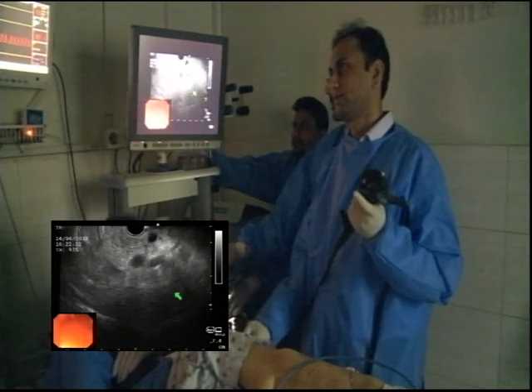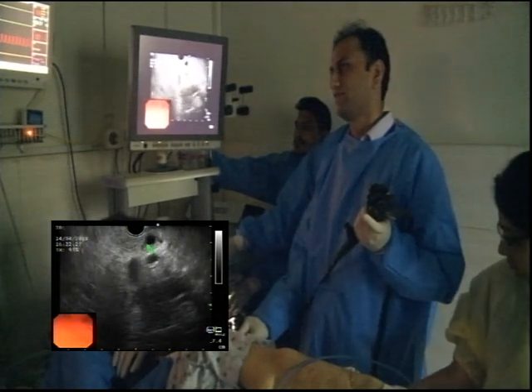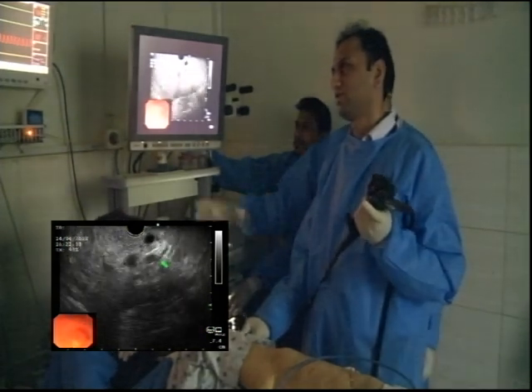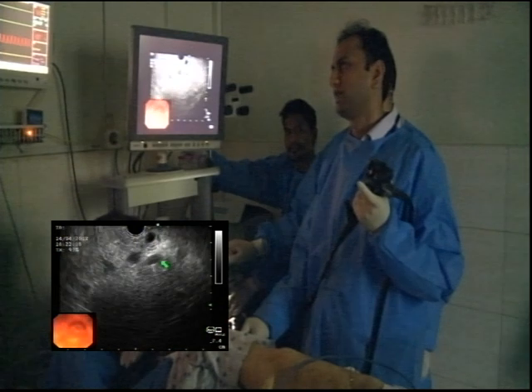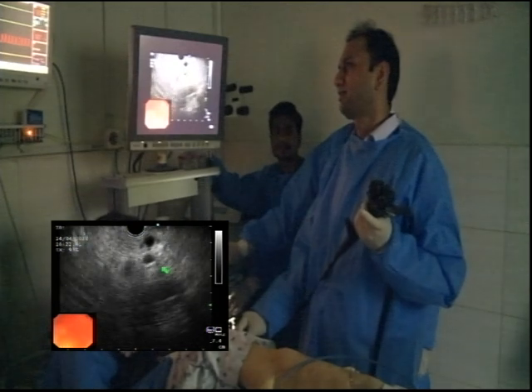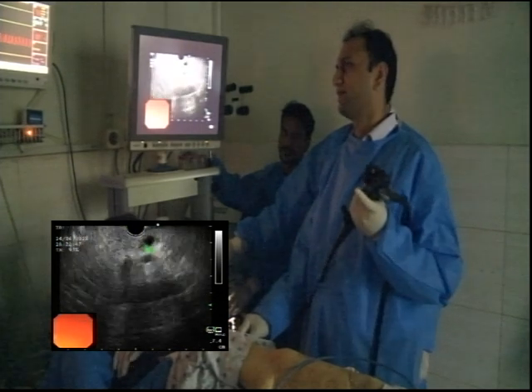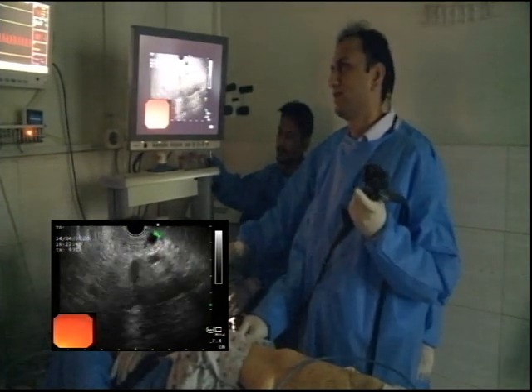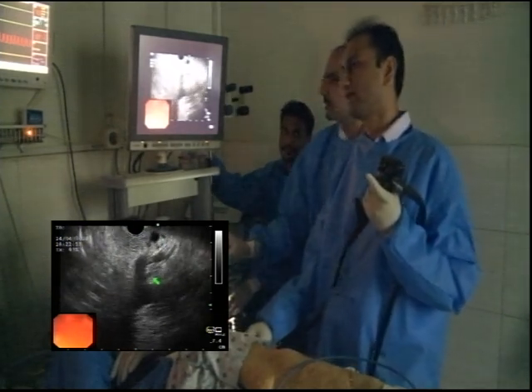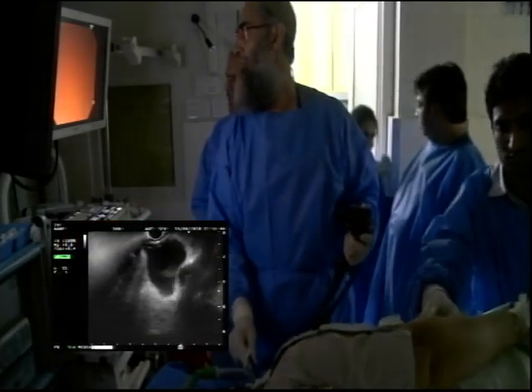So portal vein, SMV, and splenic vein. And the splenic artery. These two, splenic artery and vein again. So they'll communicate. Splenic vein is different from this tissue. I think this is different. Yeah, take a look. No, that's the splenic artery actually. It's just the artery twice. So this is more upstream and this is lower down, and that is the vein. So identify the structures. Pull back a little. Identify the structures.